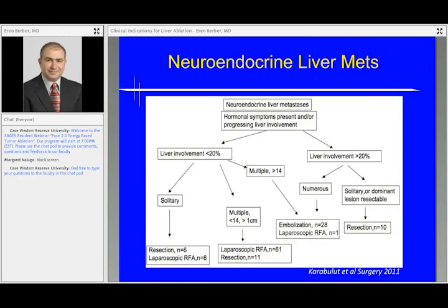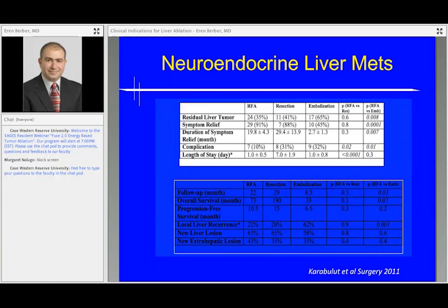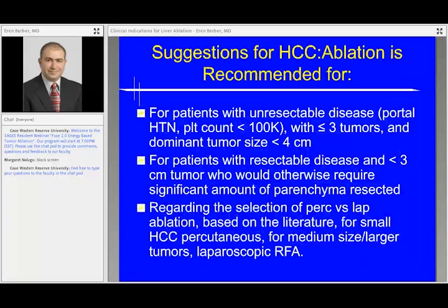And when we look at the experience at the Cleveland Clinic, it turned out that patients with isolated, discrete, large lesions were being resected. Those patients with extensive disease were being embolized, and those patients in between were being ablated. And when these selection criteria were followed, each group of patients had really favorable outcomes. I don't want to go into too much detail about this slide, but this is, I think, a reasonable algorithm to employ in a given institution.